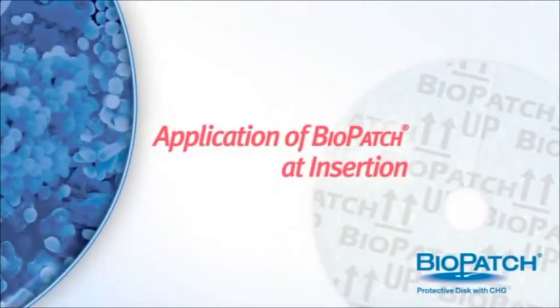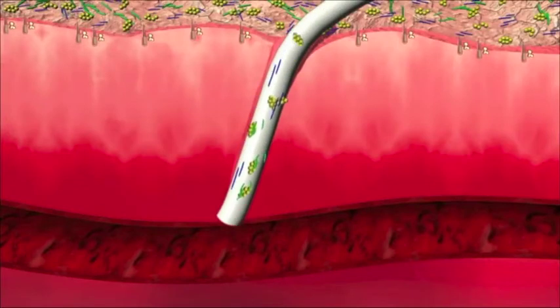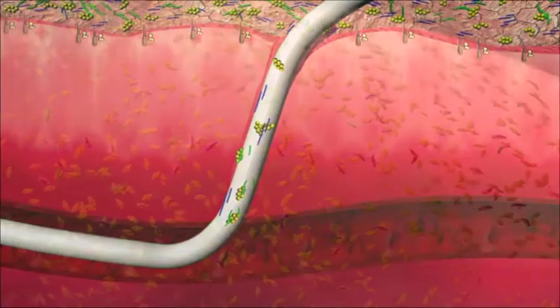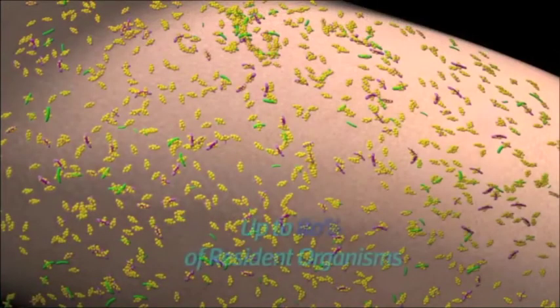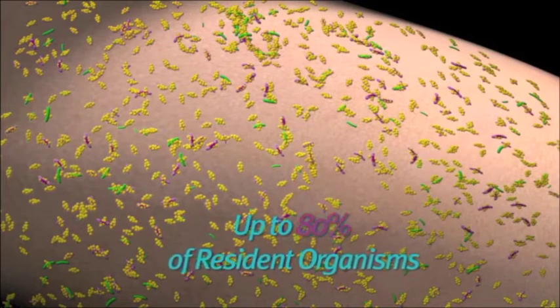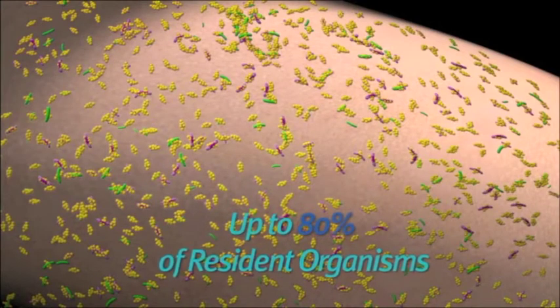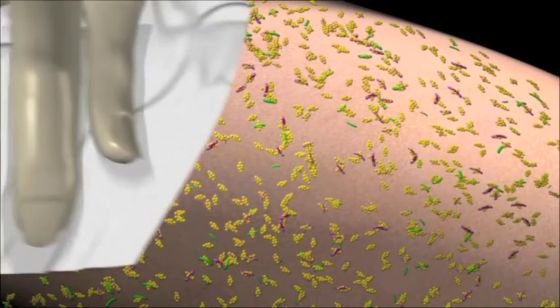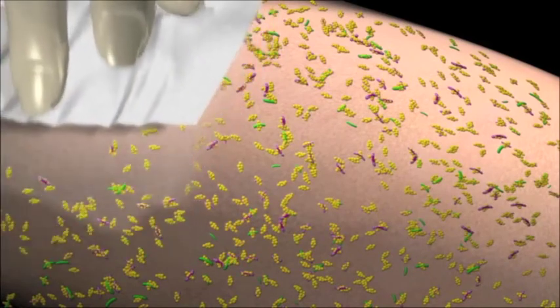When applying a BioPatch, some bacteria will invariably attach to the catheter surface as it passes through the skin layers, hair follicles, and sebaceous glands. Up to 80 percent of resident organisms in the stratum corneum can be removed by properly preparing the skin before insertion. Be sure to cleanse the skin surface according to hospital protocol.